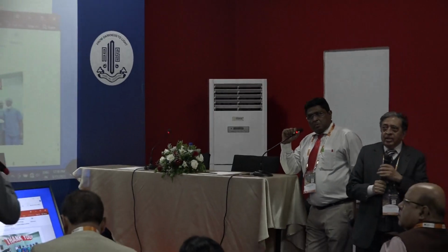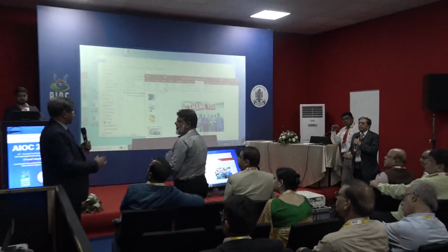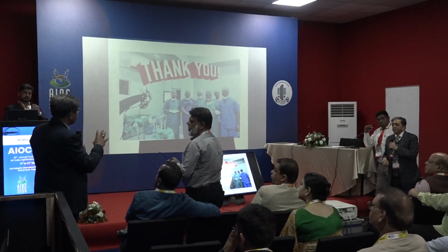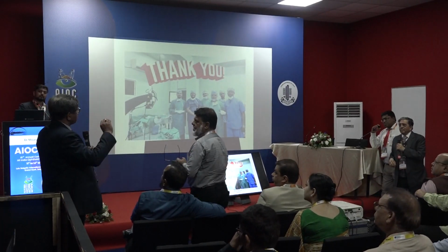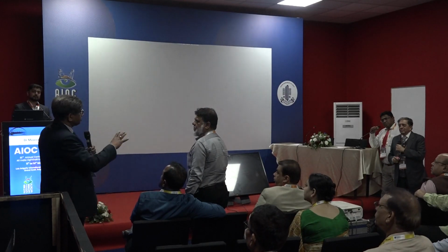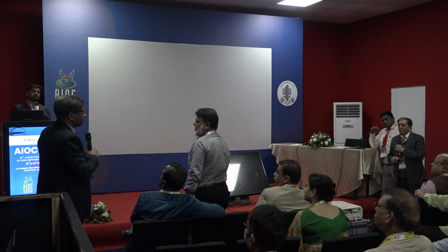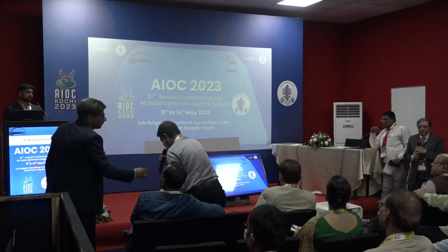So we should be very clear about alignment. Yes, you need to know exactly what the axis is. If there is any misalignment, there is a website called astigmatismfix.com. It's free. You can put the data in, and it will show how much to rotate. You have to take the patient back to the OT and rotate the IOL. Thank you. Okay, thank you.